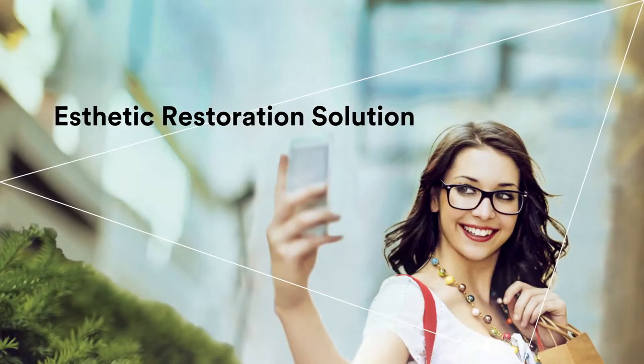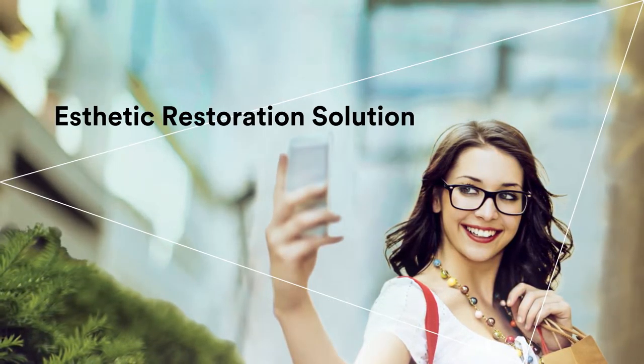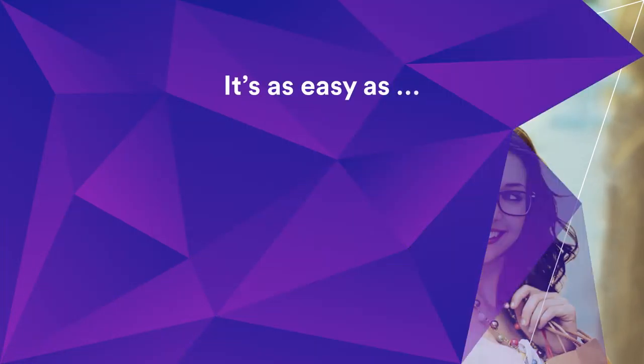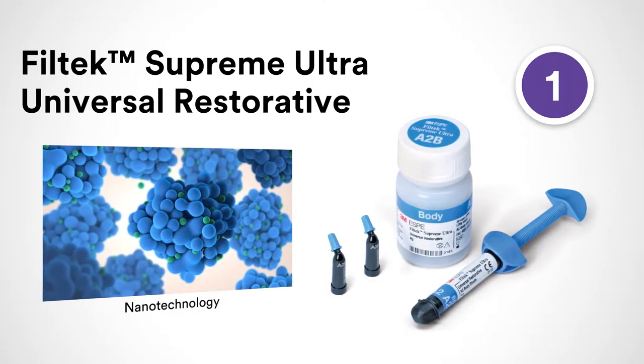There are things in life worth sharing, and now her smile can be one of them. The aesthetic restoration solution from 3M is designed to help you elevate the beauty of your aesthetic restorations with simplicity. It's as easy as one, two, three to create gorgeous, natural-looking restorations.